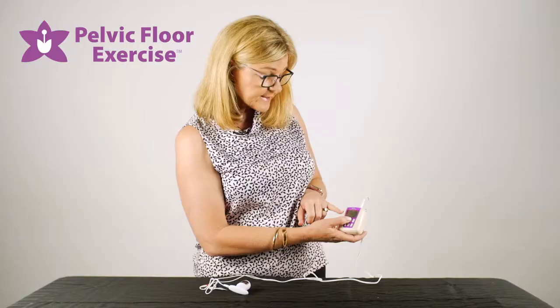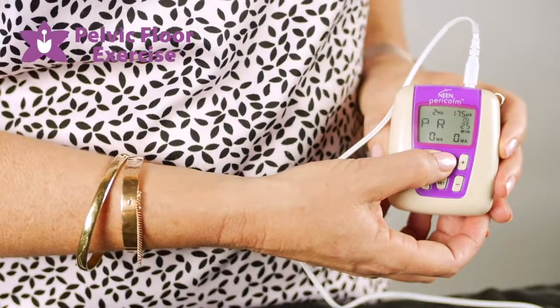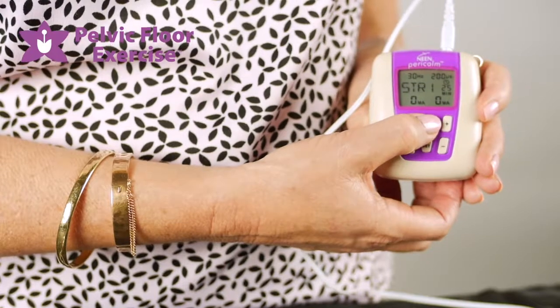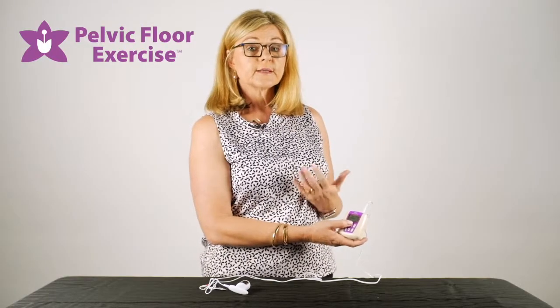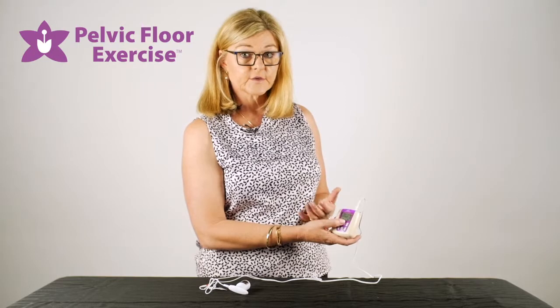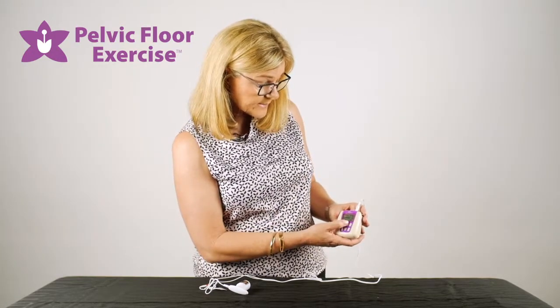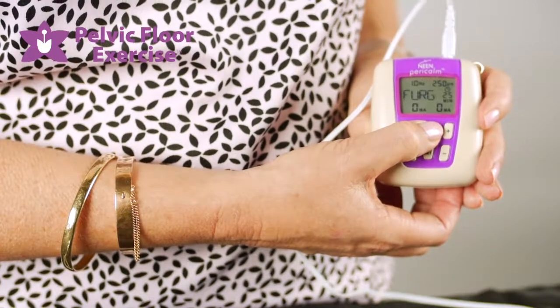Some of the program names can be a little confusing. There's PR which is a pelvic pain one, then Stress 1 or Stress 2 which relate to stress incontinence — these are actually the programs for strengthening the pelvic floor. So even if you don't have stress incontinence but your aim is to strengthen the pelvic floor, those are the programs you would use.